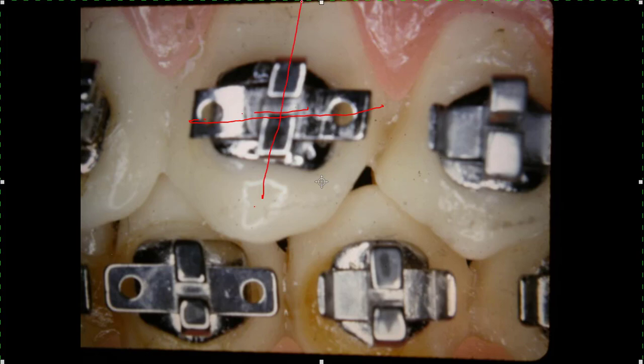The root structure - I think this is a cuspid - should be distal to the crown on the cuspids. All of the teeth have a certain amount, but not as much as a cuspid. That shows the tipping effect that the bracket has on the tooth. If you stick this bracket on the tooth correctly and then put a straight piece of wire in, it's going to line this cuspid up in that fashion.